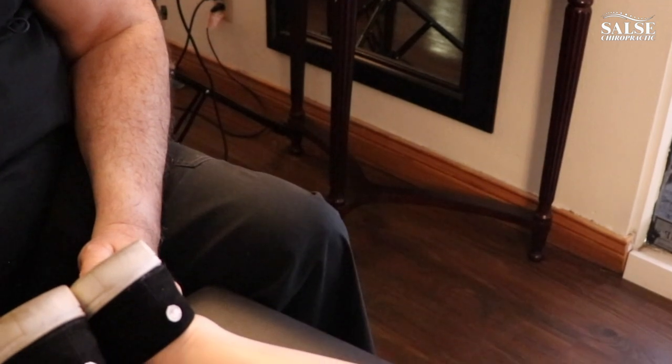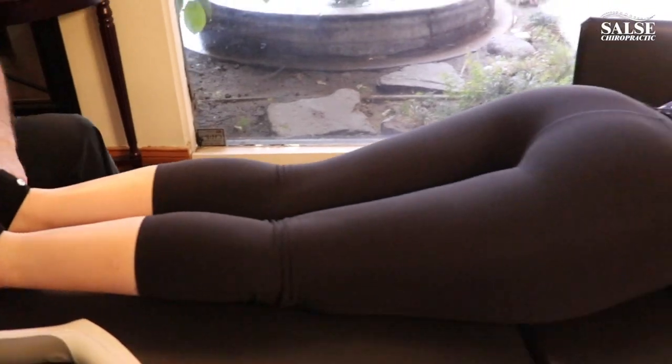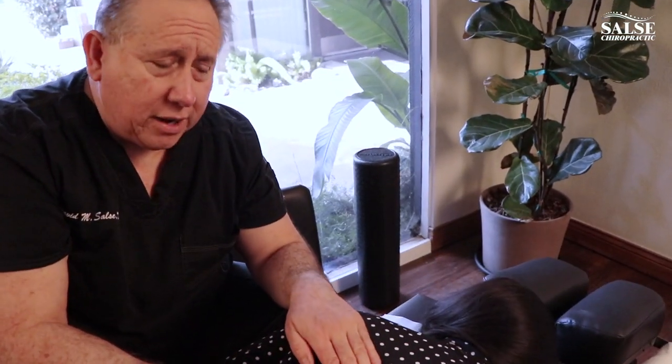Okay Rachel, let's get you to turn your head to the left. Okay, you can see how that's even. Now the reason why that happens is because when Rachel turns her head back to the left, if there's a subluxation in a particular area of her spine and it restricts, that will translate all the way down and we'll see it in her leg.